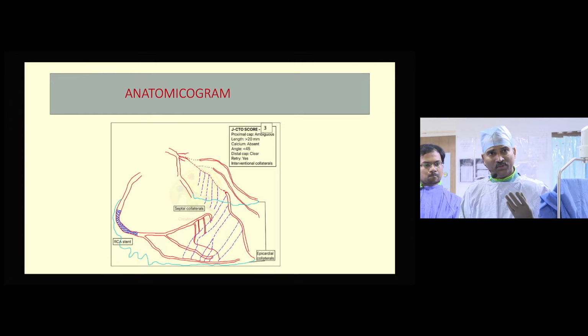I feel even dual angiogram shows similar anatomy. So after IVUS-guided entry, if I'm still not sure with dual injection where my vessel course is, then probably I'll take retrograde and do retrograde wiring, and then I'll do a reverse CART in the proximal LAD.